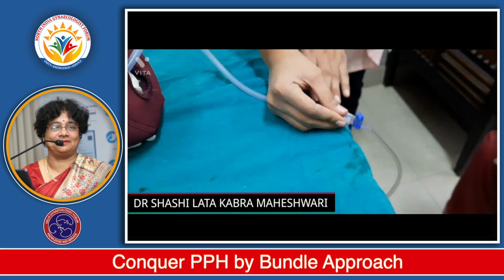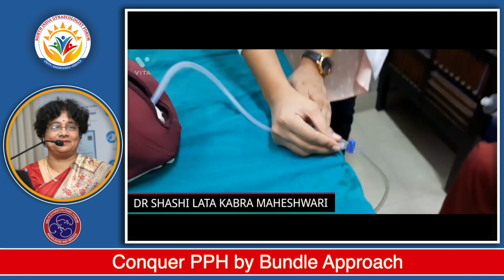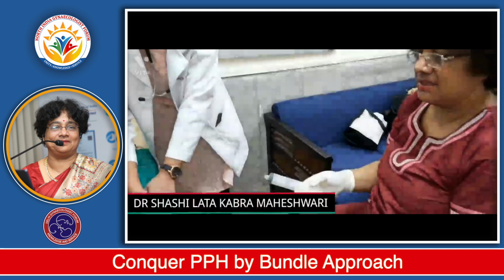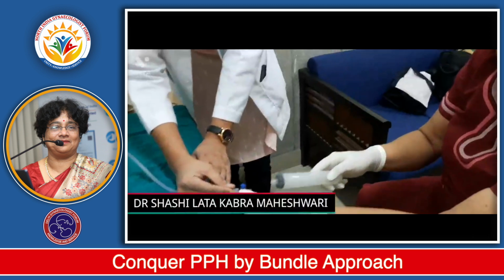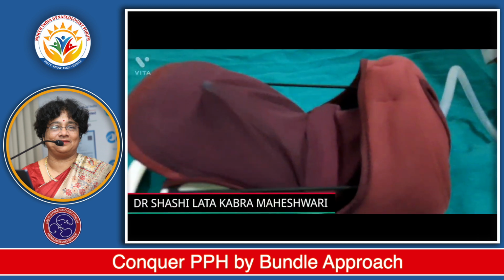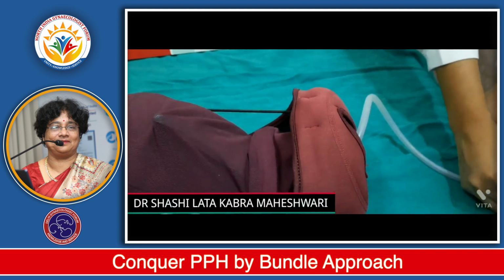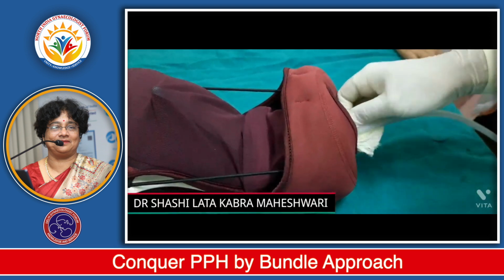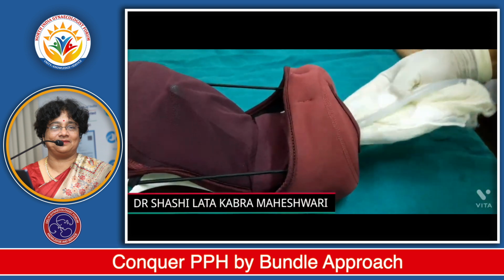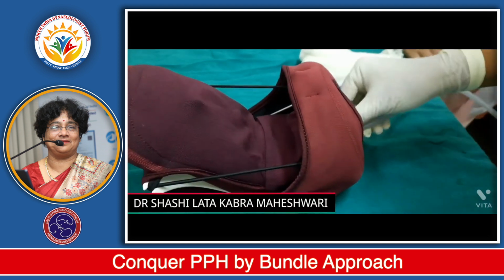Again I will watch for the bleeding, and I will see that there is no bleeding and the patient's vitals are stable. We can keep it for 1 hour like this, then after 1 hour again we can remove 50 cc, and this is how we completely remove it. So now it is completely deflated, and we can now remove it. First we will remove the pack, and then gradually we can remove it.